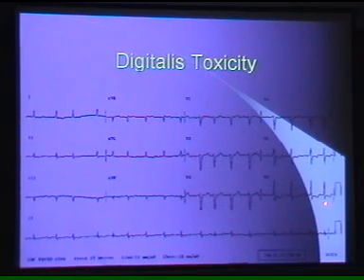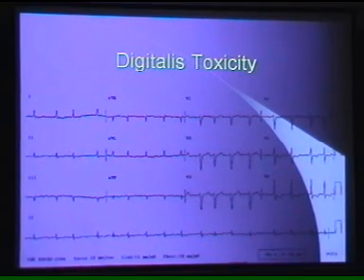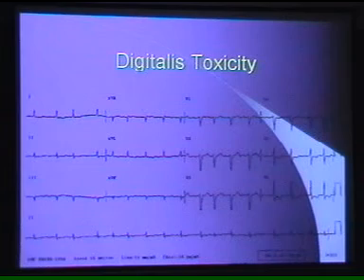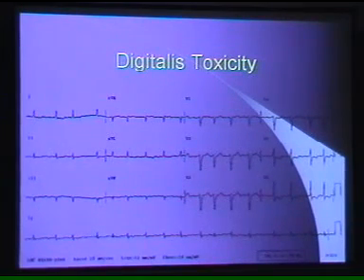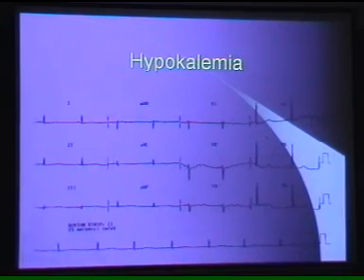Now this suggests that the drug being taken is reaching toxic levels, and stopping this would control the possibility that the person does not develop more serious cardiac arrhythmias later on. Next one.